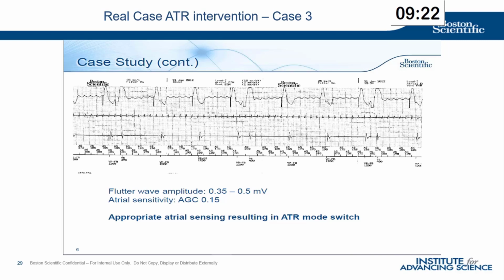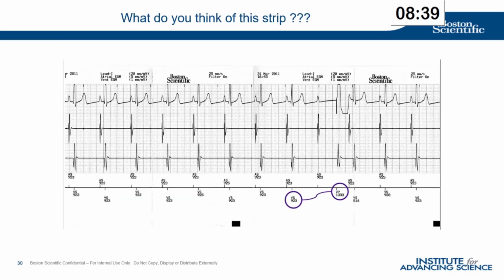Some of the people, maybe key opinion leaders, think that this is a little bit of a conservative feature, but others might say that this is how we need to take into consideration any pacing avoidance concept or principle, to avoid any drop-off, to avoid any pauses, and also to avoid short or long pauses that might happen to trigger something more critical.